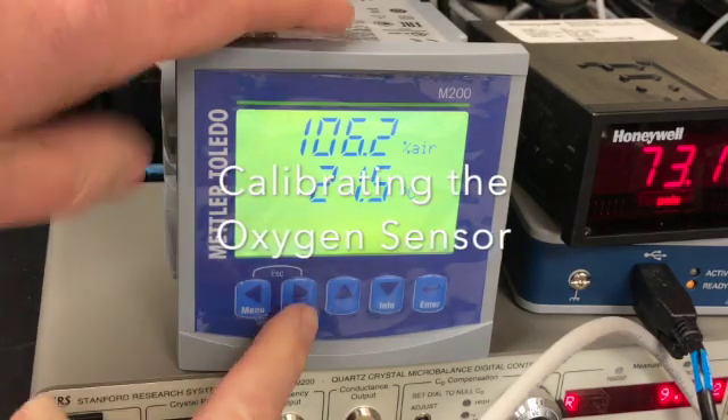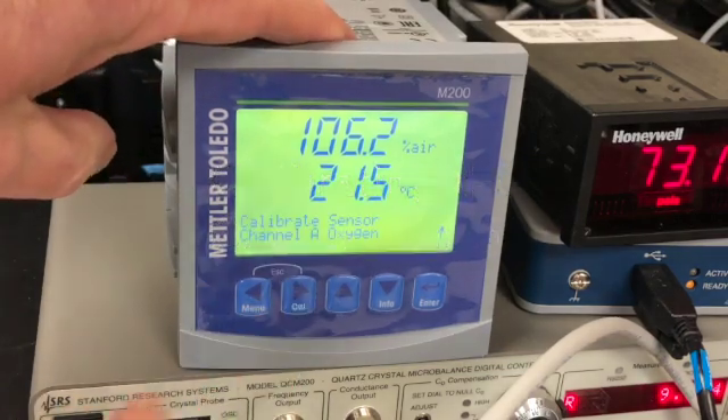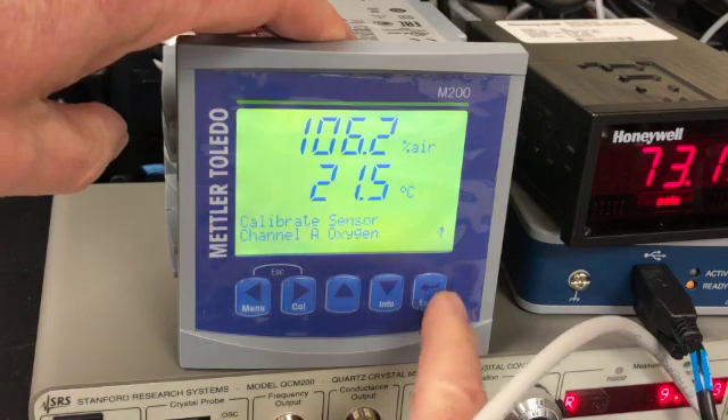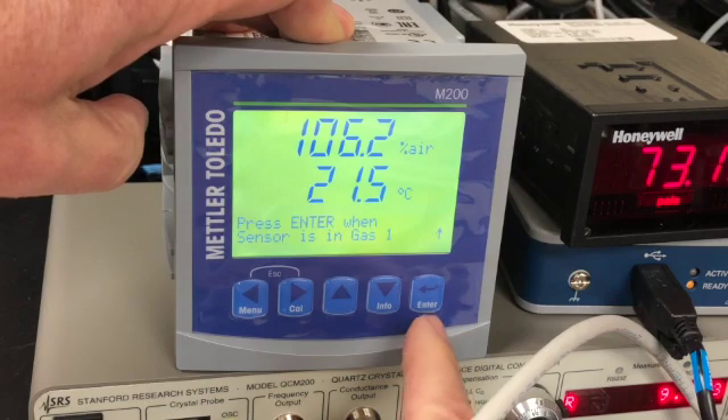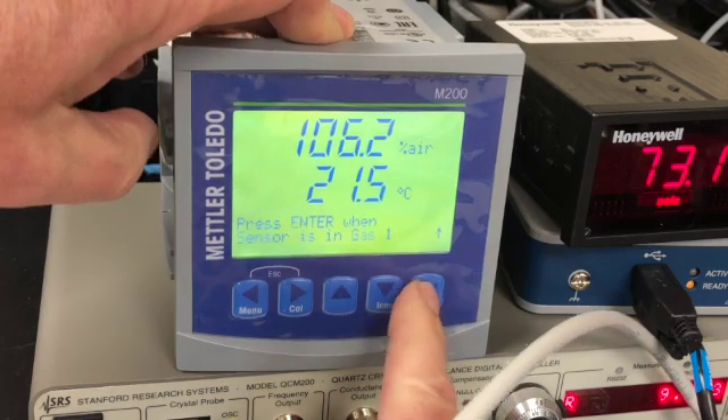The oxygen sensor should be calibrated before each run. Press the calibrate button, press the enter button, press the enter button again, and press the enter button a third time.